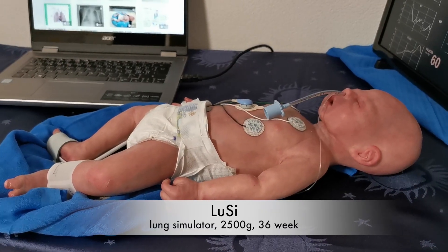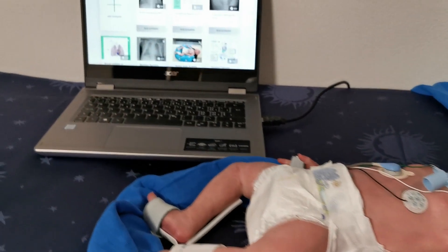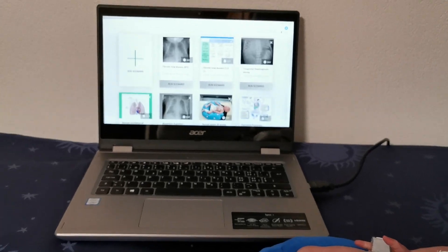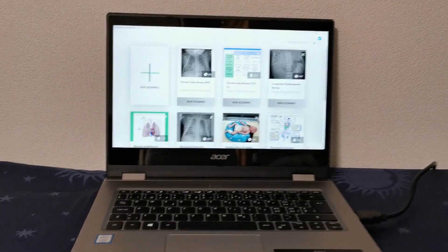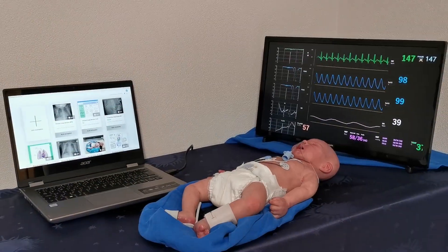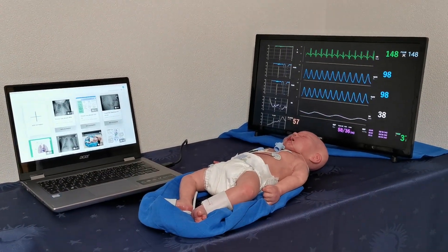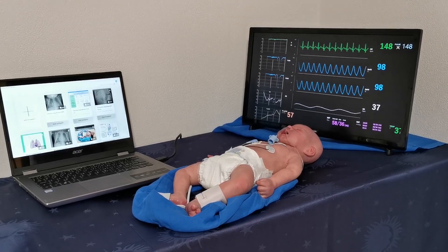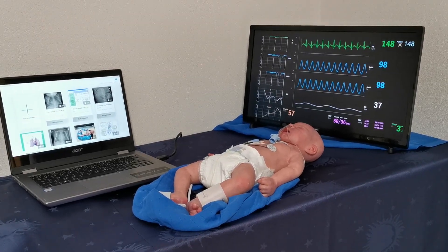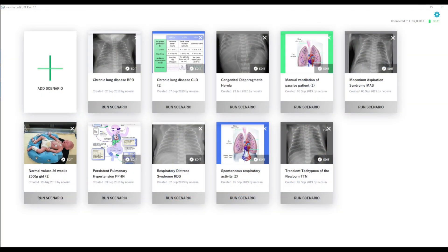The LuSi system consists of a baby with integrated lung simulator plus Windows-based software to create cases, load cases, and display vital signs in real time. A library of cases makes the start easy.